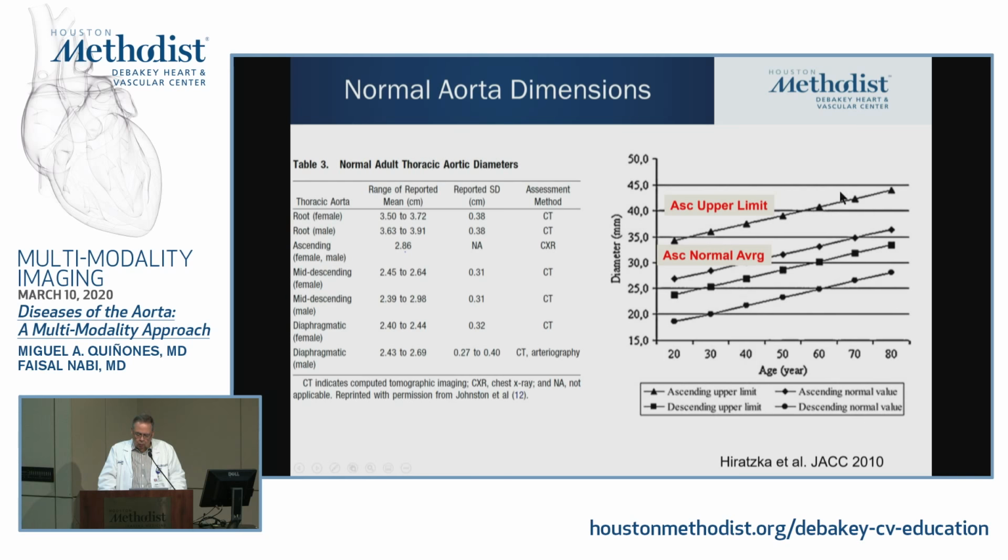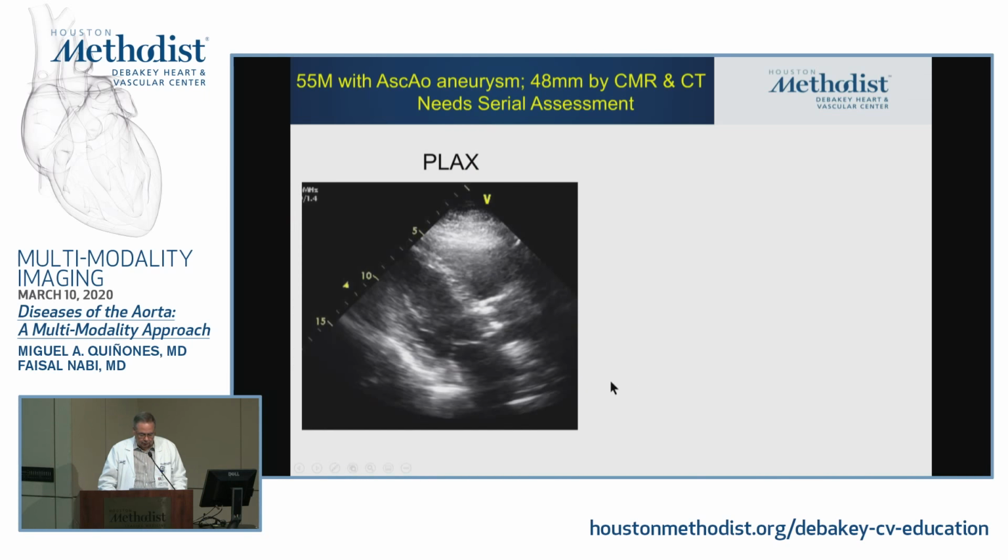So, when we get those aortas that are looking in that 4.2, 4.3 range, before you say mild enlargement, take a peek. Male, yes or no? Hypertensive, yes or no? Body size, big or not? Because then you may want to change that statement to upper limit rather than enlargement. And those statements that we send to the clinician have importance to them. I mean, they do say mild enlargement, they may be thinking we have to repeat it every 2-3 years or whatever. So be careful when you make this statement, because it may be just a simple normal upper limit for that particular patient. And that's basically the take-home message.